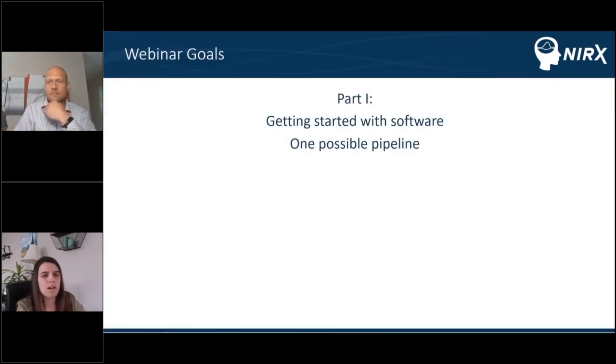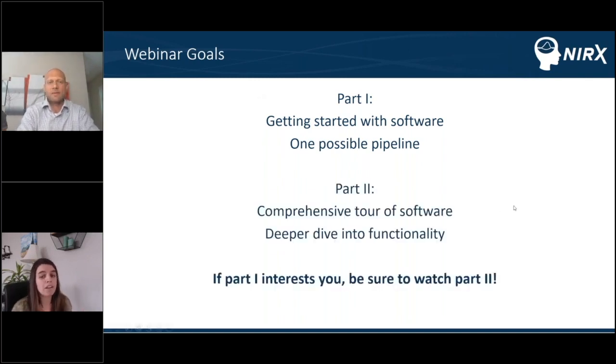So the goals of this webinar, Eric already introduced the specific agenda points, but I just want to reiterate that we have split this webinar series up into 2 parts for a reason. The purpose of this presentation is really to just get you started with the software and show one possible pipeline. The intention is not to show you all that Satori can do, because it's a lot. My goal is to set you up for next week's presentation by Satori's creator, Dr. Michael Lührs, which will give a comprehensive tour of the software and a deeper dive into the functionality, and show you all that Satori can do.